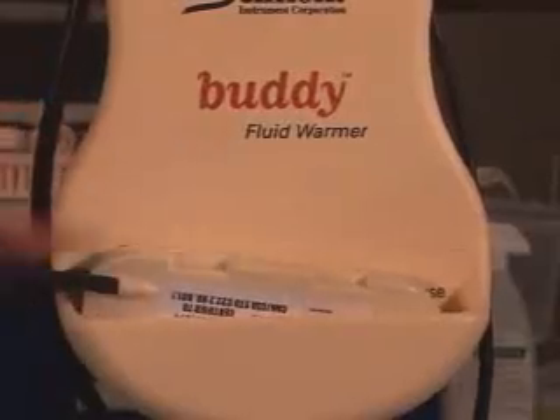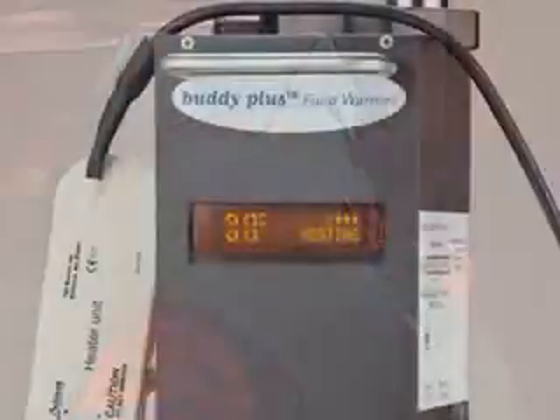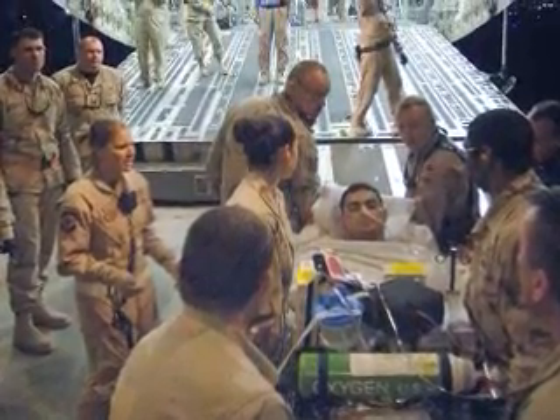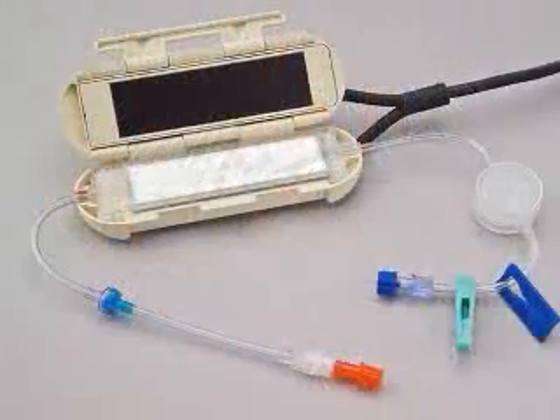The ingenious disposable is tiny enough to remain in line at the end of the procedure. A battery-powered version, the Buddy Plus, is also available. It is designed for mobile use including air transport, and is capable of giving at least 5 liters of fluid before charging.